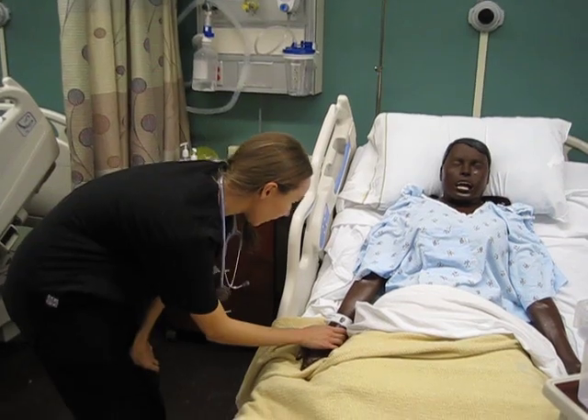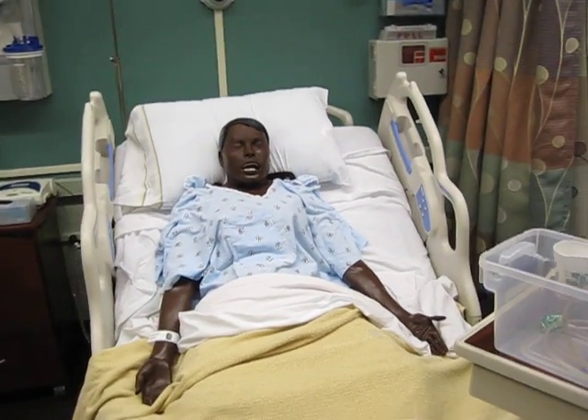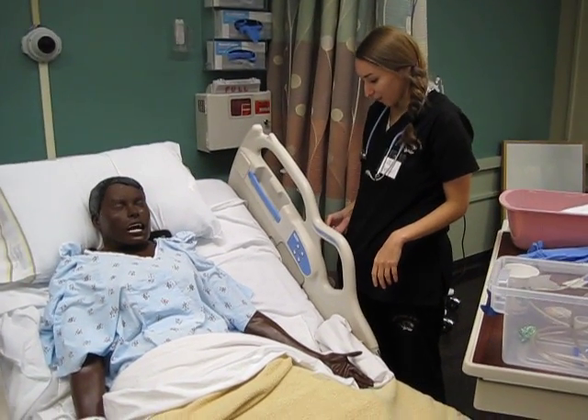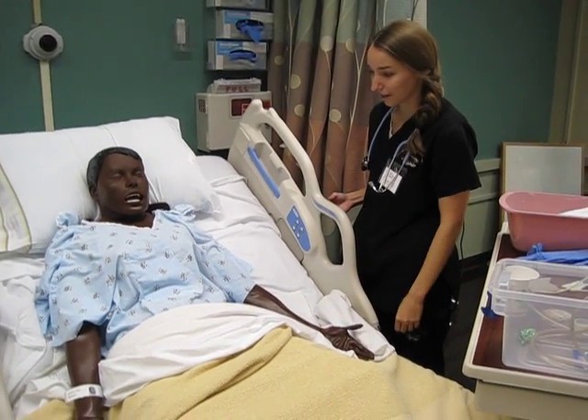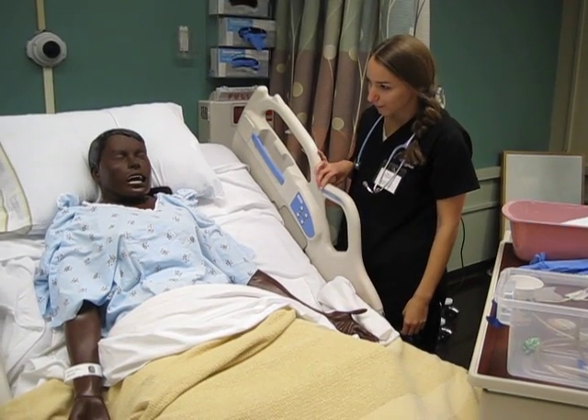And your date of birth? Today we are going to be doing a nasogastric tube on you. We've been noticing that you've been having some problems with your nutrition, and you're also at a high risk of aspiration, so we're going to put that tube down so that way we can feed you properly. Do you have any questions for me?